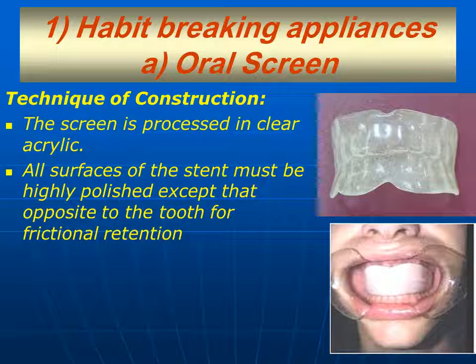All surfaces of the stent must be highly polished except that opposite to the teeth, for frictional retention, when we use it for orthodontic purposes. However, when we use it for other purposes, it can be properly polished.